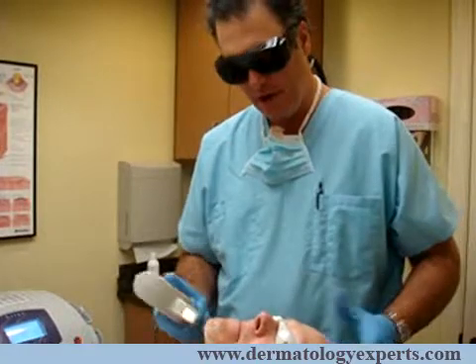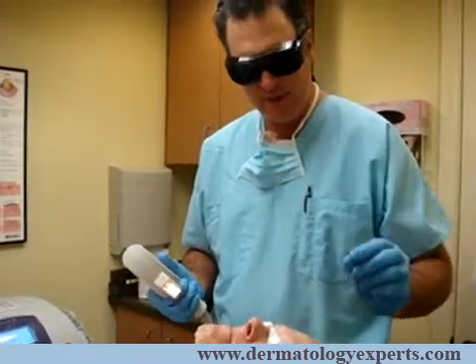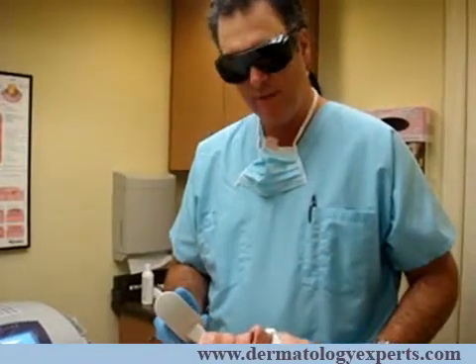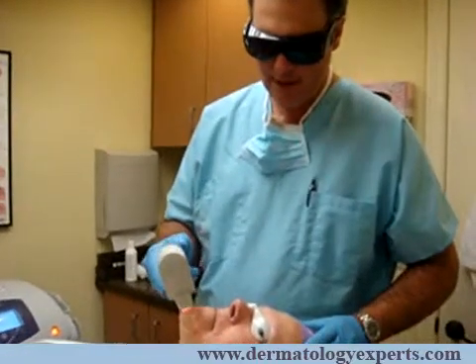I'll tell the patient: okay, on one, two, three, you're going to see a bright flash of light followed by a snap against the skin. One, two, three. And again. And again.